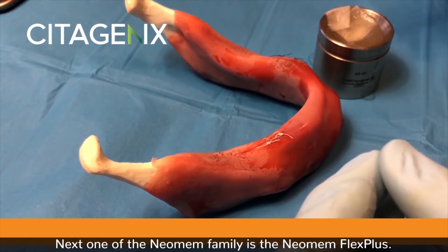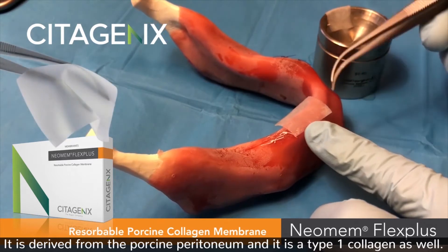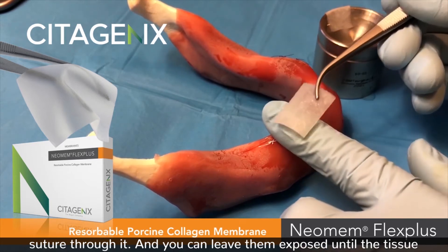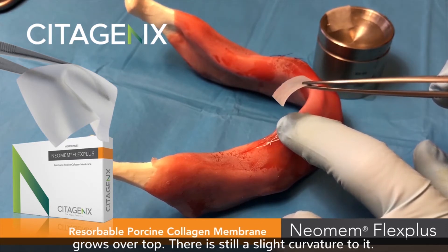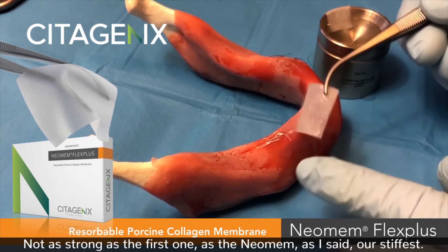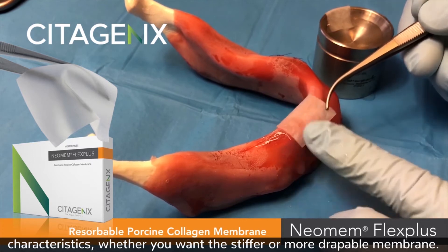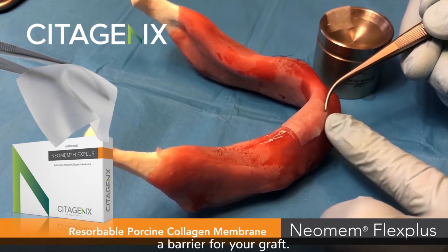Next in the Neomem family is the Neomem Flex Plus. It is derived from the porcine peritoneum and is also a type 1 collagen. It has cross-linked fibers so you have the strength to suture through it, and you can leave it exposed until tissue grows over top. There is still a slight curvature to it, but not as strong as the original Neomem — which is our stiffest. This one is way more drapable. So it's a choice of handling characteristics: whether you want the stiffer or the more drapable membrane. Both are type 1 collagens used as a barrier for your graft.